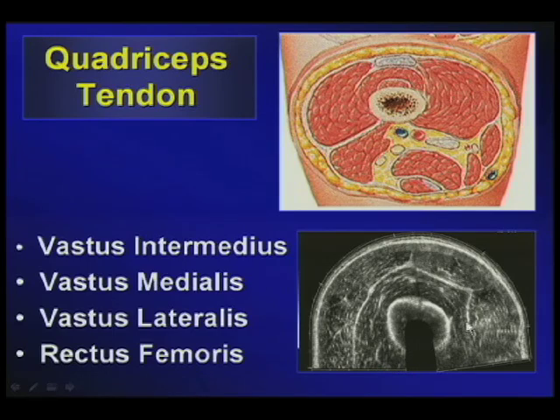Around the femur, in a short axis view, because it's short axis view, then you can expect a bristle pattern of muscle, which is the vastus intermedius. To the medial aspect, you have the vastus medialis, and then you have the vastus lateralis. Dr. Netter's drawing shows a little whitish tendon because the rectus femoris is represented more as a tendon, in comparison to our image, where we chose a level showing muscle of the rectus femoris.